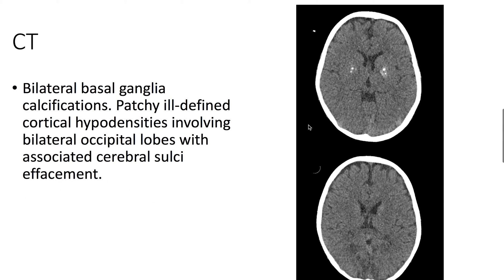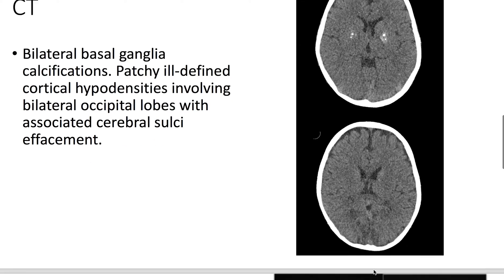On CT, we see bilateral basal ganglia calcifications and patchy, ill-defined cortical hypodensities involving the bilateral occipital lobes.